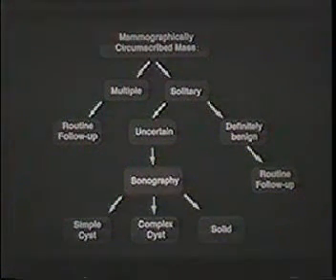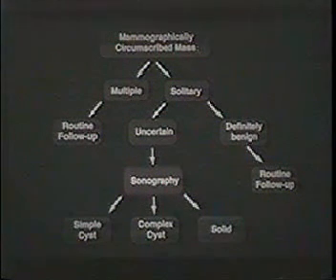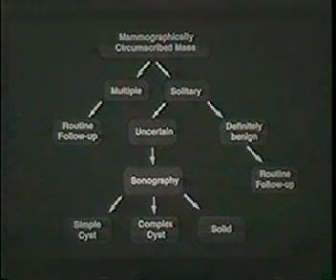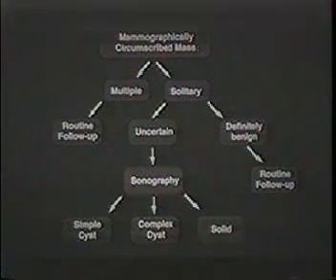Doing sonography usually will either confirm that they're cysts or will show that they're solid, but it doesn't matter because if there are multiple solid circumscribed masses, they also follow the rule of multiplicity in that they will be benign. And doing ultrasound just adds expense to the workup, anxiety for the woman, and it may lead to an unnecessary biopsy because if you find a solid mass, report a solid mass, often these women end up with a biopsy.